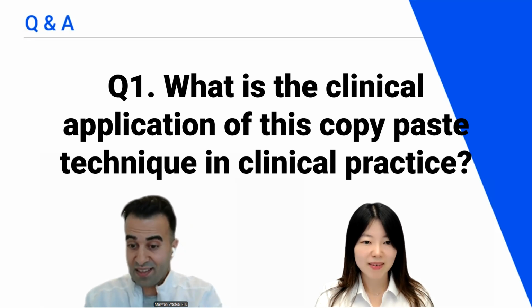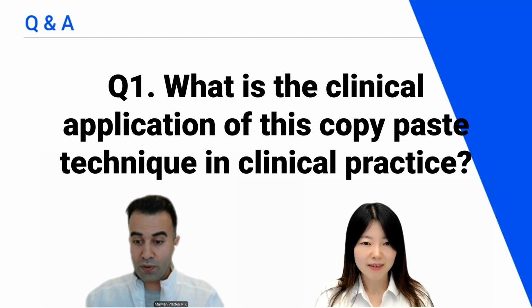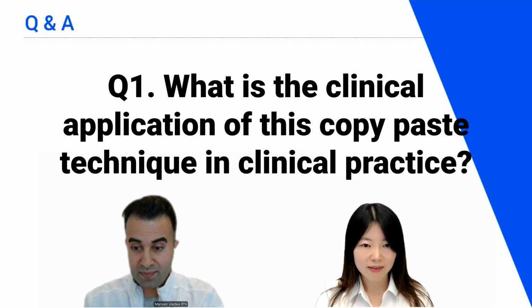I think it's really valuable, not only for dentures, but even for ceramic. If we are working with monolithic milled ceramic restorations, we can do the same with the shapes, and technically copy paste the teeth. I think there are so many clinical applications.